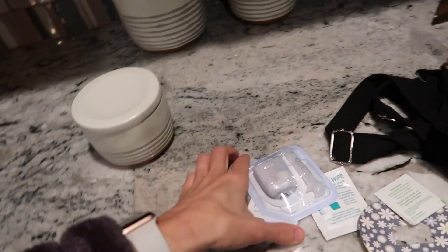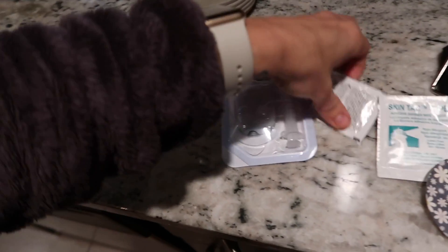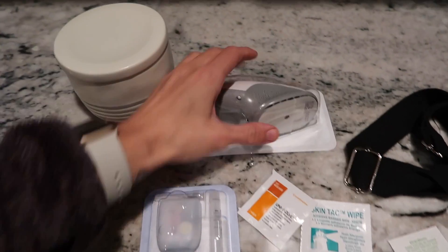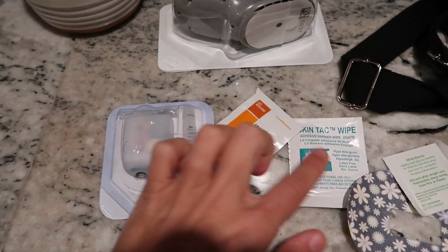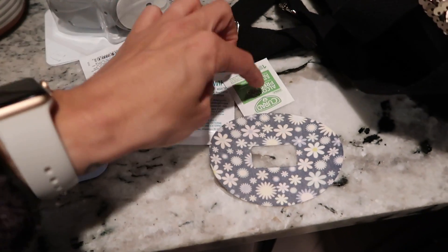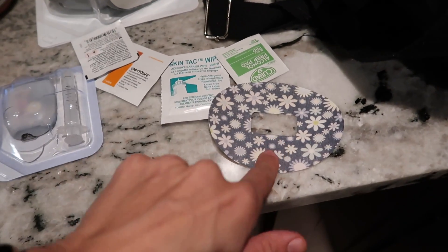This is what she's got so far: a new pod, Unisolve — you should probably get two of those — her Dexcom, skin tac, alcohol wipe, probably another alcohol wipe, and a sticker.